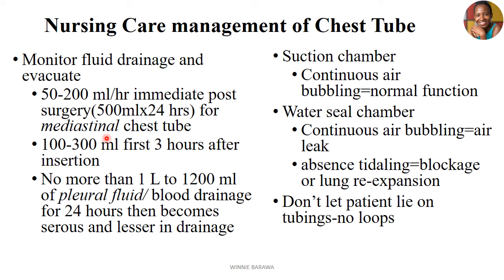However, if you observe in the water seal chamber continuous air bubbling, that means there's an air leak. And if there is absence of tidaling, it means either there could be an issue with blockage or the possibility that the lung has re-expanded. So it depends on the different aspects. In the water seal you'll be observing differently, and in the suction chamber we'll also be observing different aspects.